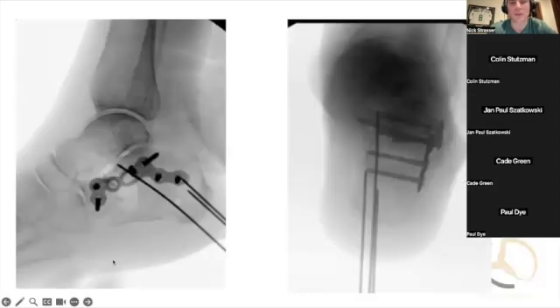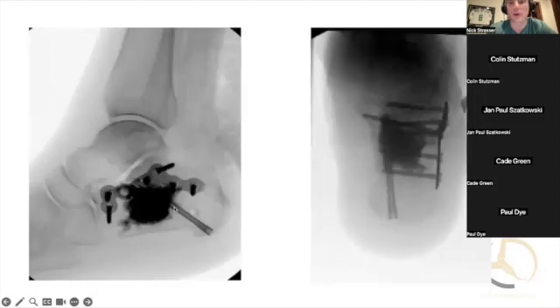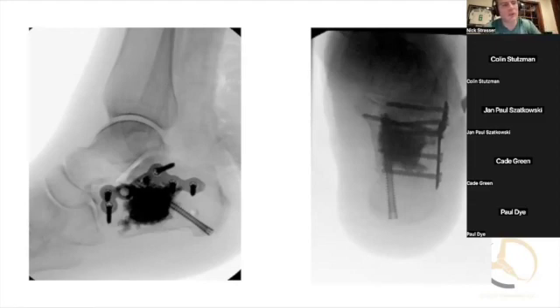In this case here we got that pretty well pulled out of varus, got our K-wires holding things, and then we use one of these wave plates through a sinus incision. You can see there's a pretty big hole, so in this case we use Cerament to backfill that area and then use the screw on the medial side to try to hold that piece out of falling into varus. This would be an example when I'll backfill that area. They've described using allograft but also bone substitute or artificial bone substitute as well.